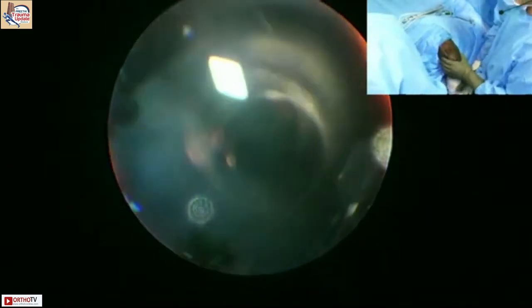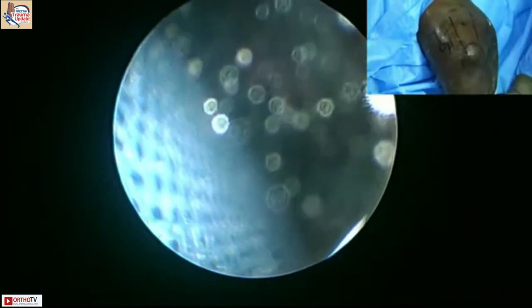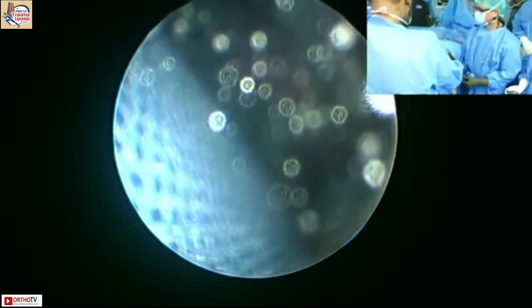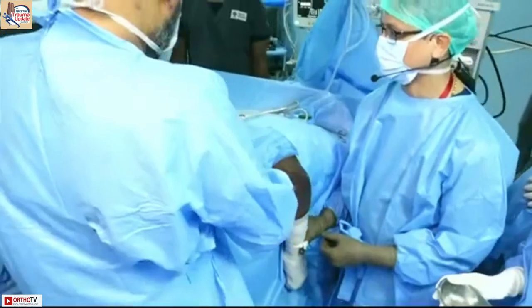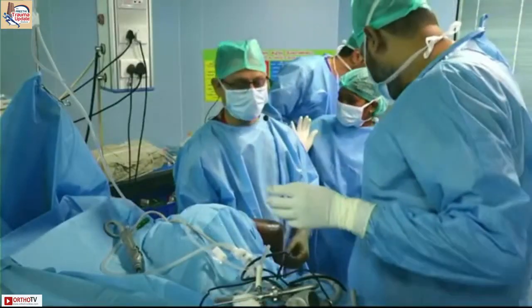Right, knife please. So you can see the elbow is already swollen, yeah? So you're going to go posterior. Two ways: you can go mid or trans triceps, or you can go medial lateral. The problem with medial lateral is the ulnar nerve. That is when you have to really hold the ulnar nerve in your thumb and then go posterior. So there is merit in doing posterior first.